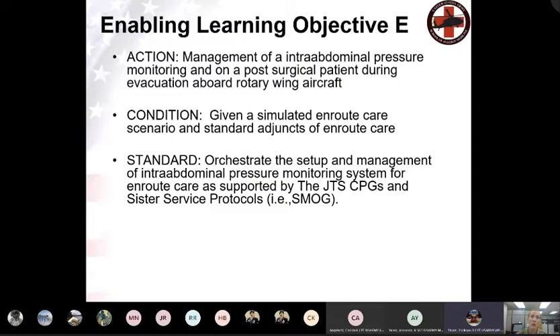I'm not sure I'm tracking with that common catheter. It will have the tail that you plug into a pressure cable, and that pressure cable is plugged into your monitor. So on your monitor, you will have pressure ports, okay? And those pressure ports are not specific to the source. So whether it's a CVP, an ICP, an abdominal pressure, or an arterial line, you can plug it into that pressure port on your monitor.